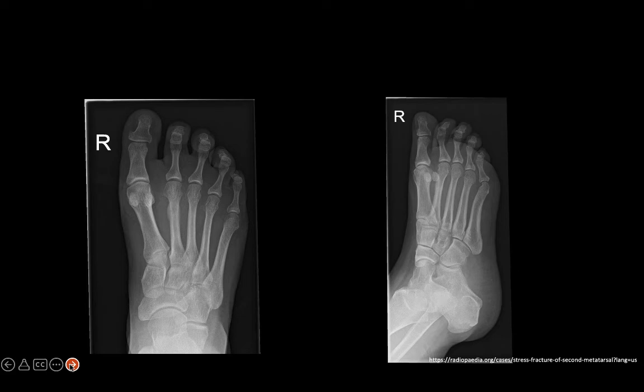Okay, next, let's talk for a moment about stress fractures. We did mention them briefly in the discussion of pars interarticularis stress fractures seen in hyperextenders, adolescent time frame generally. But there's a bunch of different stress fracture locations that are common around the body other than the pars. And this comes to mind when we see this case of a stress fracture occurring at the second metatarsal.